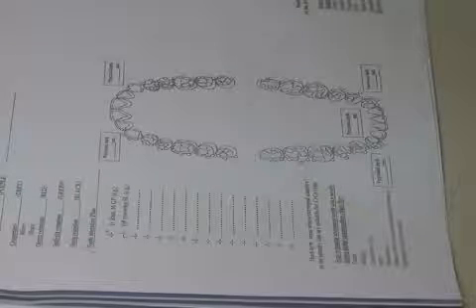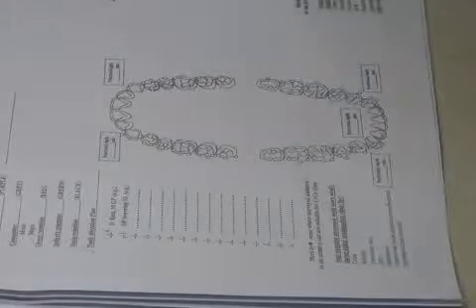So sometimes one tooth will have multiple preparations, or you'll have multiple teeth other than the abutments with preparations in, okay? Especially if they have interferences. Now, if you go down here, this is the part you did not fill in, and we did not do in our initial design. You remember the first lab when we did the initial design. This is a bit more advanced.